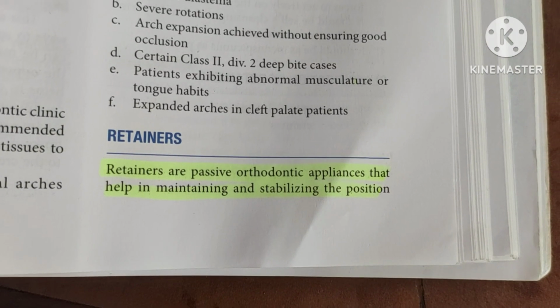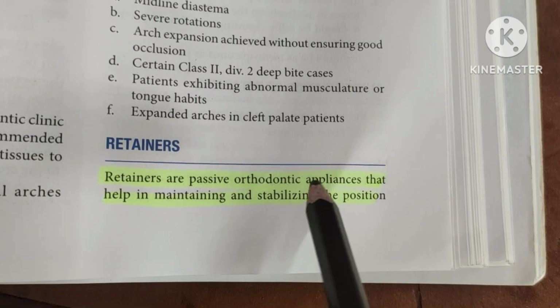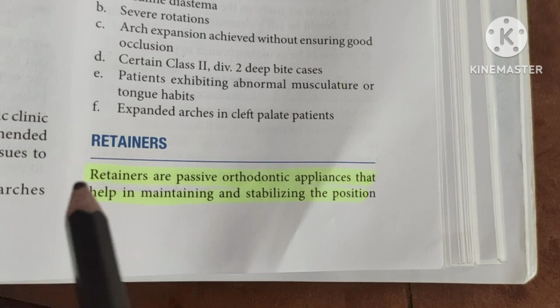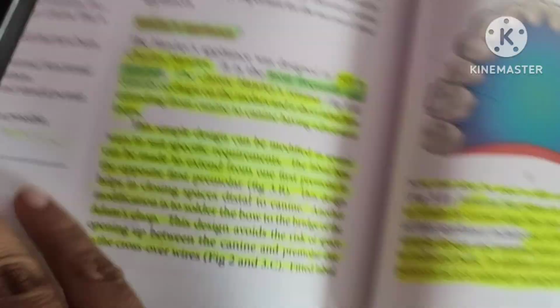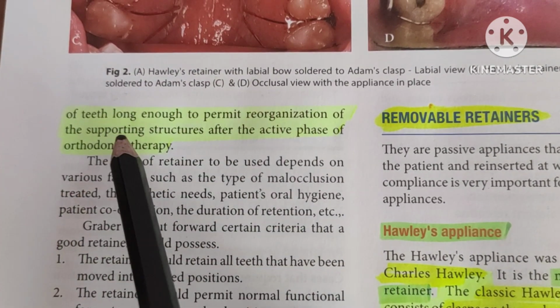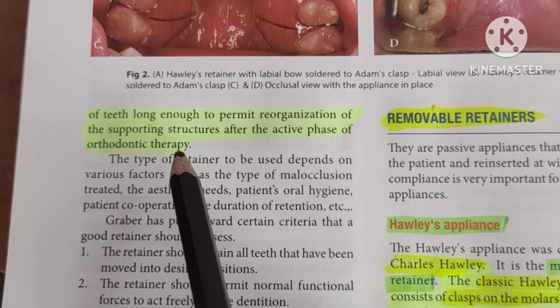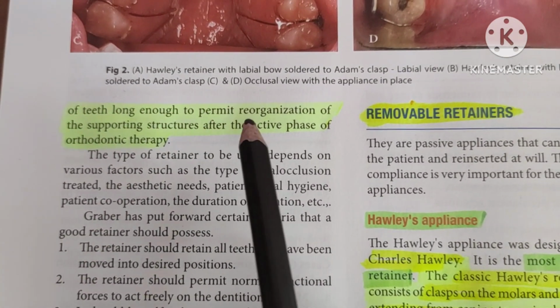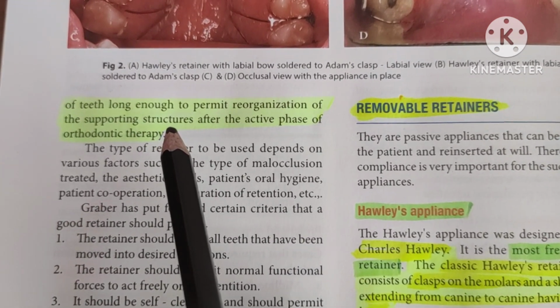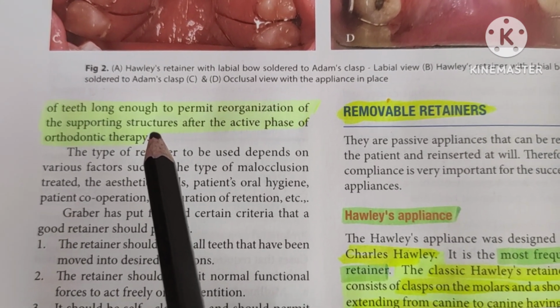Everyone, today we'll be studying about retainers, so let's begin. Retainers are passive orthodontic appliances, that is, they do not exert any pressure. A retainer is a passive appliance that helps in maintaining and stabilizing the position of the teeth long enough to permit the reorganization of the supporting structures after the active phase of orthodontic therapy. That includes structures like the principal fibers, the gingival fibers, and bones like the osteoid bones.